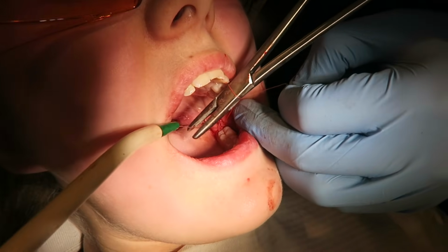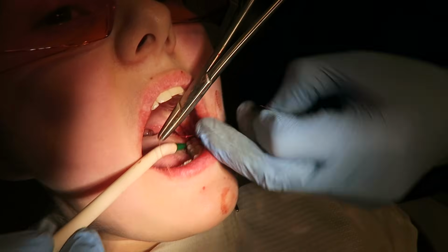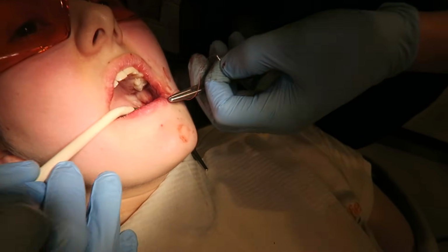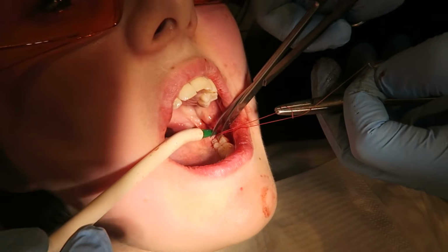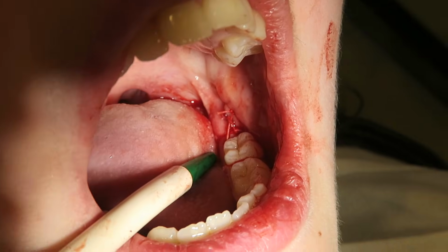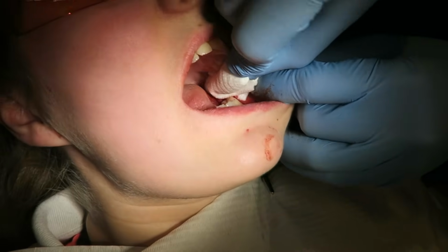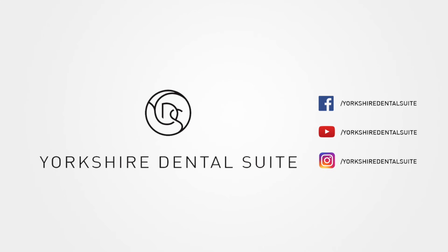Okay, so that's your suturing, and then once suturing is finished, you clean up and ask the patient to bite on a damp gauze for a good few minutes. Once you achieve hemostasis, give the patient post-operative instructions, not only verbally but in writing as well.